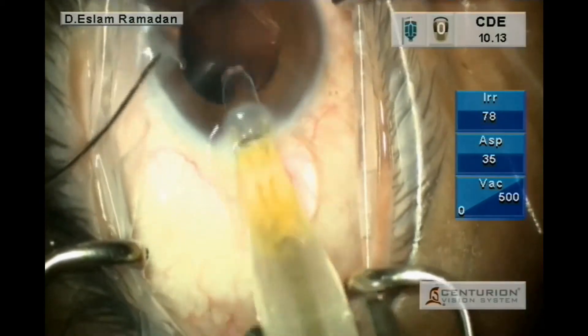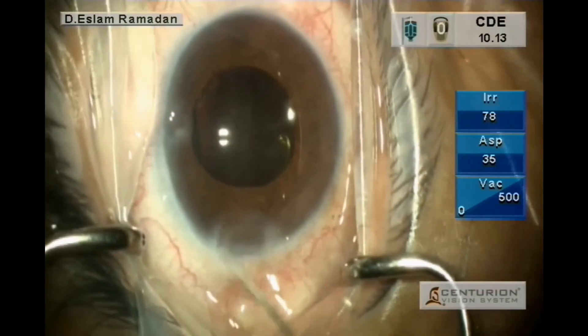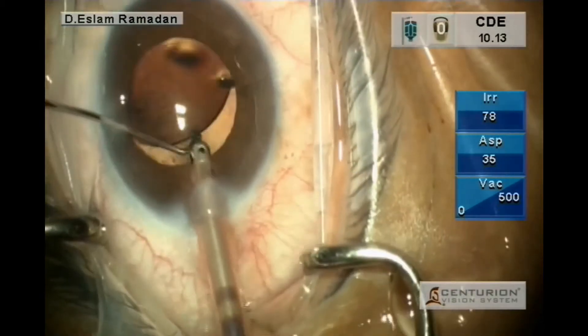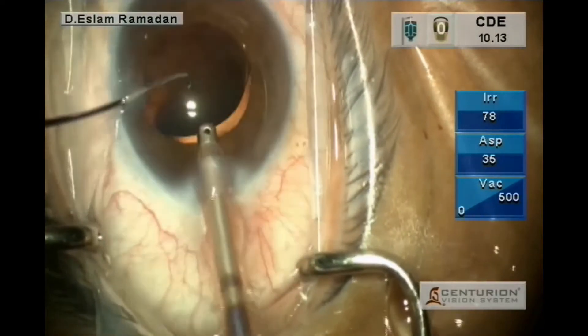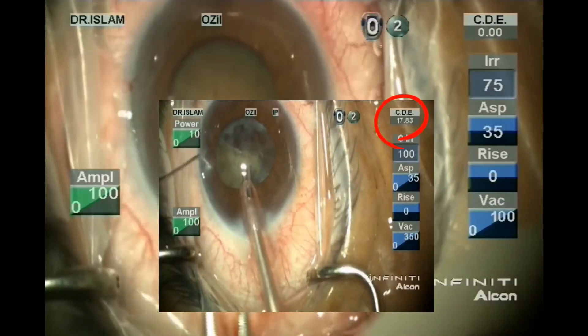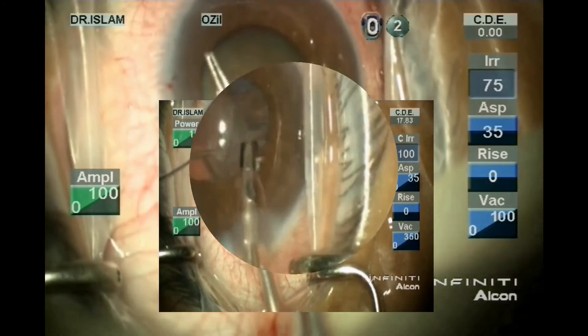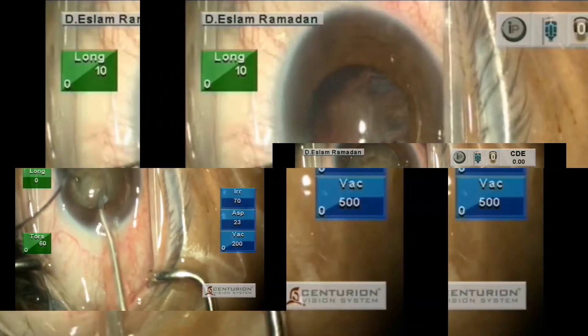So you can use both hands, as the second instrument will protect from jumping of the intraocular lens. Then cleaning the viscoelastic with irrigation aspiration. As you can see there is a difference in the CDE: 17 in Infinity and only 10 in Centurion.